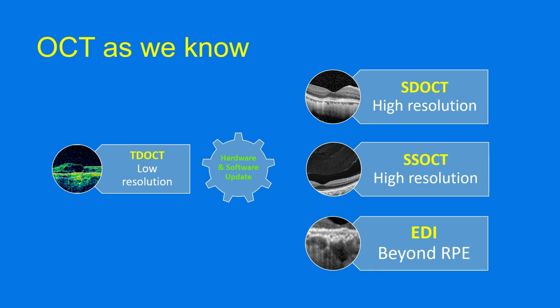Today we are going to present a new video which is called Directional OCT. So what is Directional OCT? To answer that question, let us see how the OCT has evolved over the last decade or so.